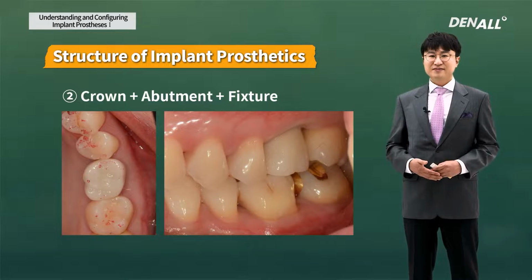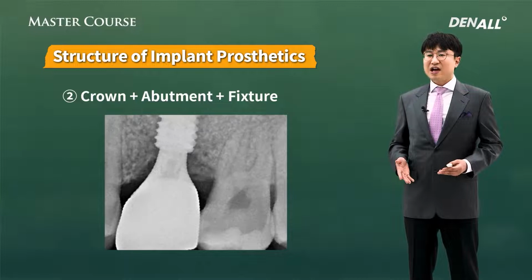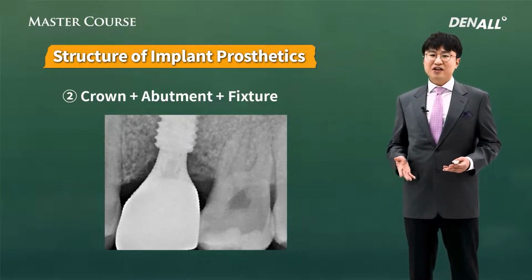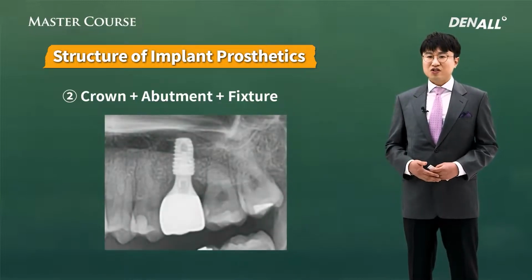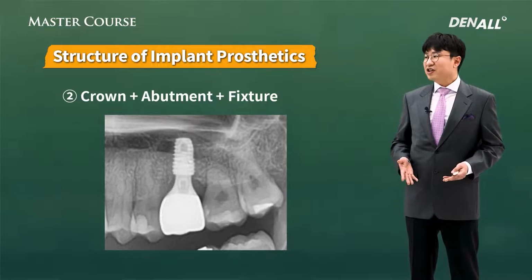The abutment needs to have the right form and shape for stability. So in the master course, you will learn more about the abutment also.